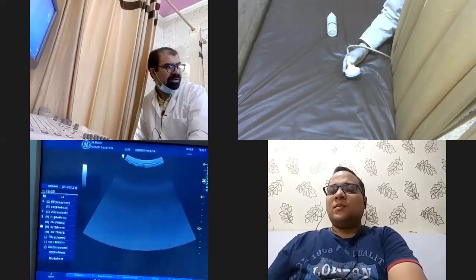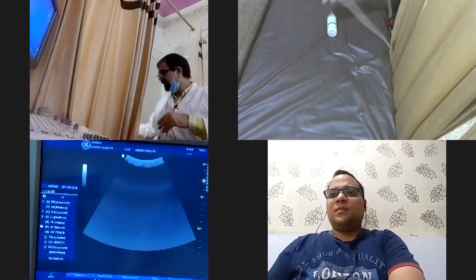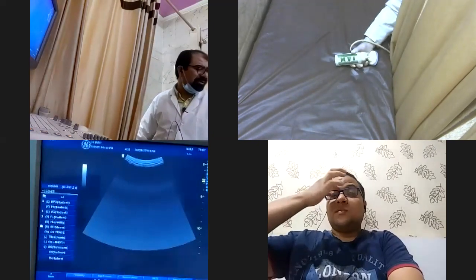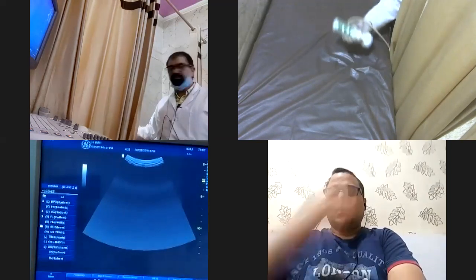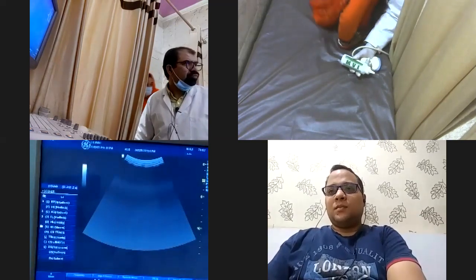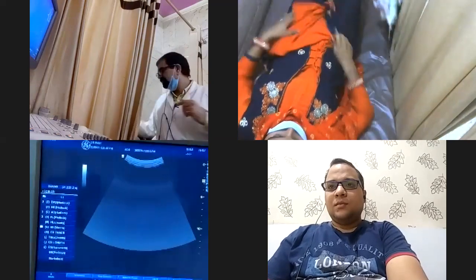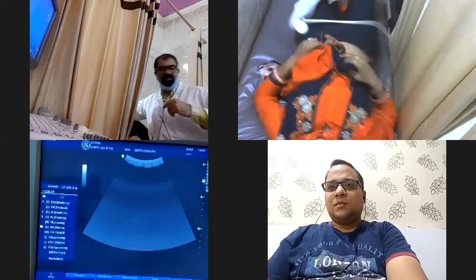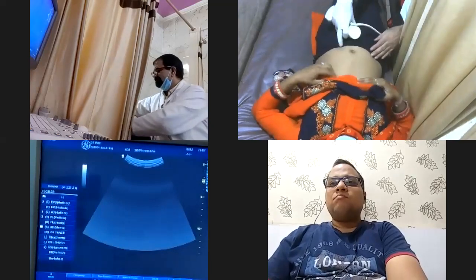Clear? Yes, sir. Now, let me take one patient. I will show you on the patient. Manjit, get the patient. Now see, this is the patient over here. Up, up, down, up.